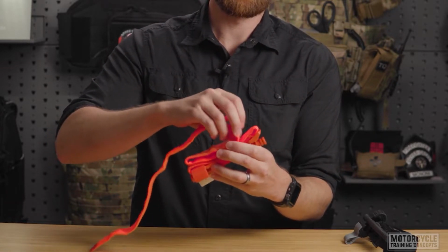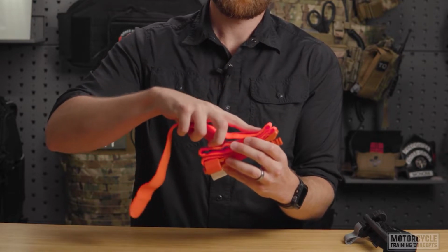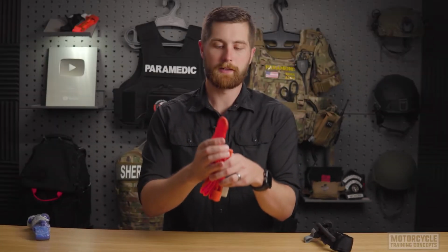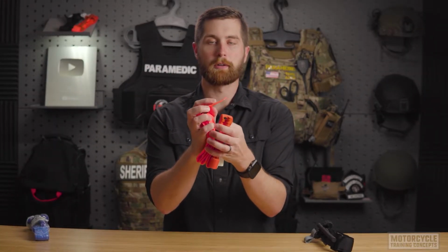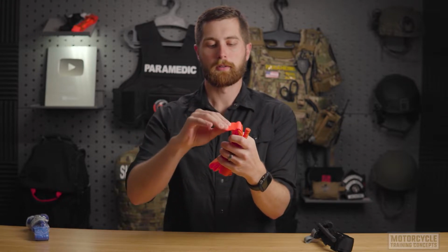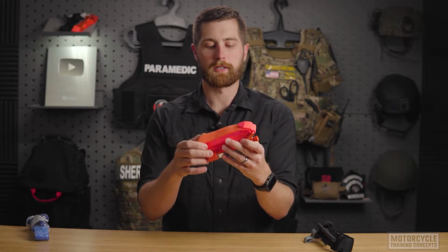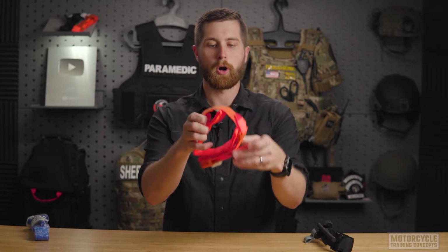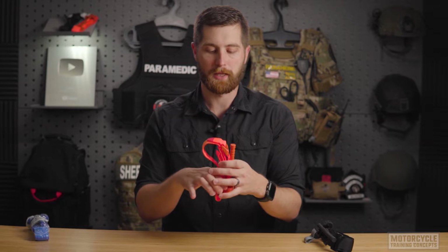to go back again and again until I get to the end of the strap and I just have a little bit left over. And then I'm going to take that, put that through the buckle and put it on over itself. And this will give you the same thing. It's even a little bit easier to put your arm through and expand it for self-application.